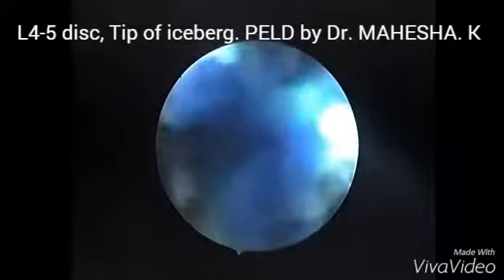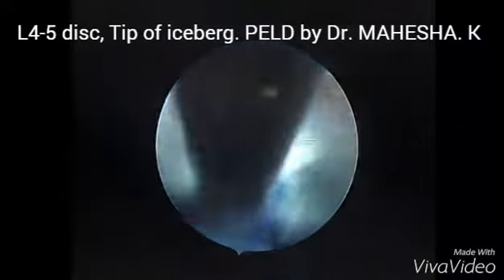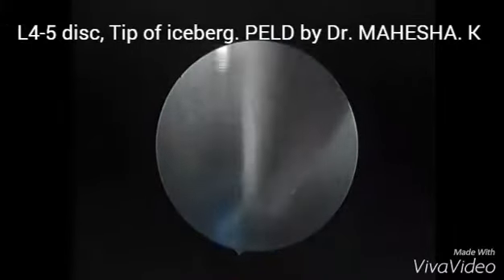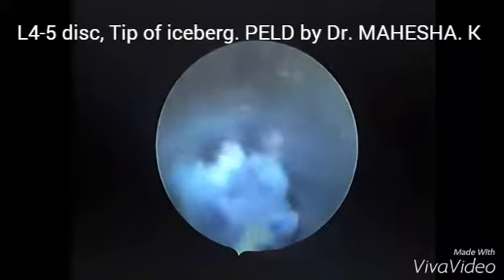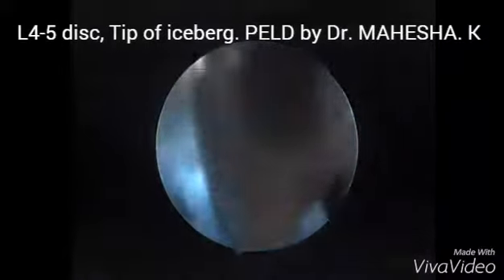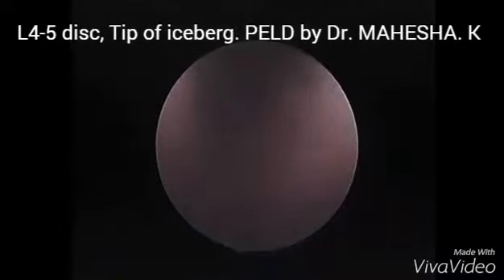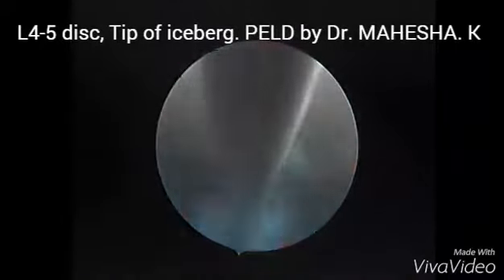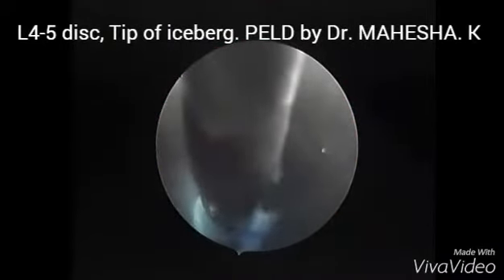The disc material is stained blue with methylene blue. I have removed a little bit of disc material to expose the base of the herniation. As you see here, there is a massive disc herniation and the herniated fragment is visible now. That's why I have called this the tip of the iceberg, because the MRI shows only a small disc protrusion.